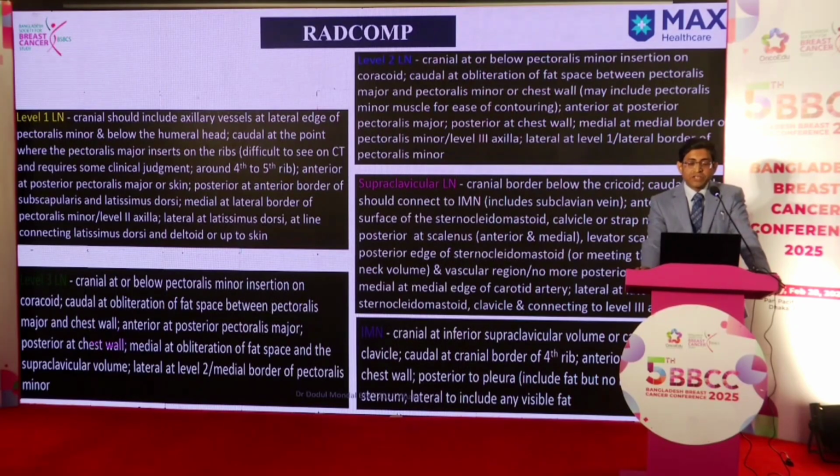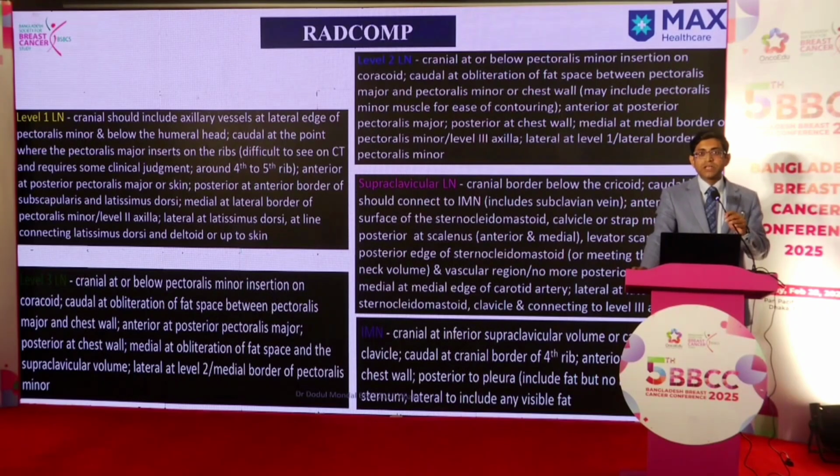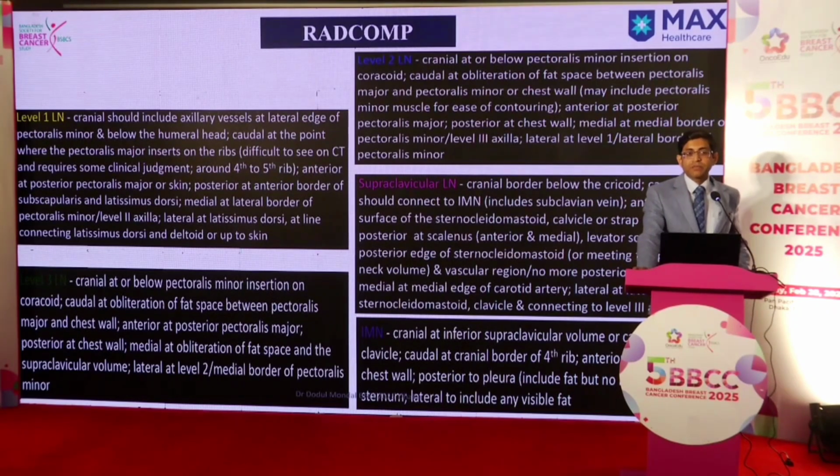So the RADCOMP guideline is very extensive, and basically it's to compare proton with photon. So the structures contoured, the CTVs, are usually quite large. As a routine, most of the nodal regions will get radiation under RADCOMP, and that's a huge structure. And when you treat a left-sided breast, probably we will be able to see the result in future that proton is better in sparing the heart in such situations.